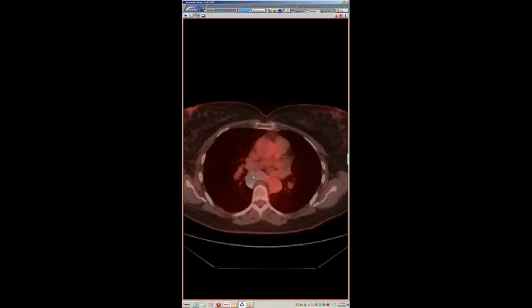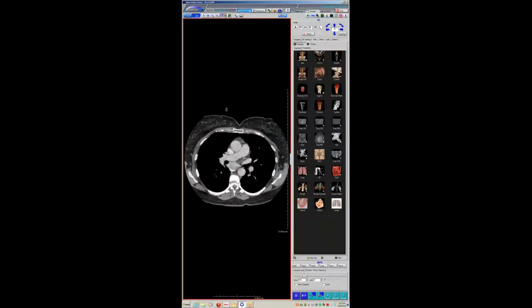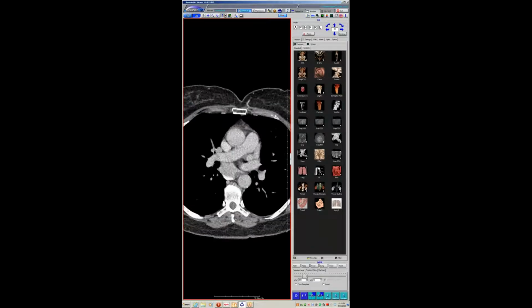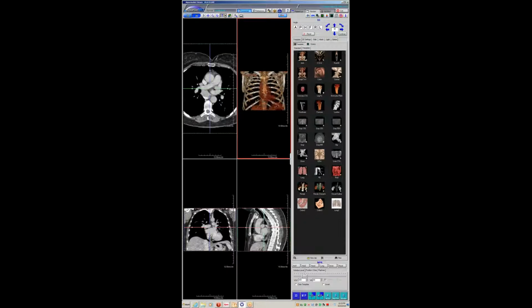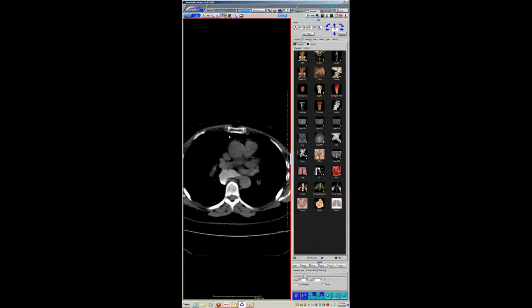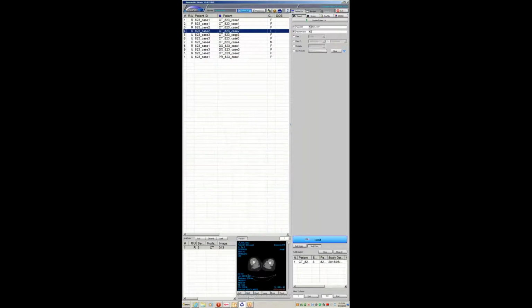But I think on the contrast scan, because the contrast attenuation in the vasculature was similar to the adjacent cyst, there was some confusion about the diagnosis. But it's a classic location and a classic appearance. If you made this fluid attenuation or low density, I think most of us would make that diagnosis. Have other people seen ones this high density? No, I don't think I've seen one, that's the highest calcium. That's really neat. It was right on the PET. You can definitely understand why the confusion was there. But on the non-contrast, it comes out really pretty. So, just an interesting one. I don't think I've seen one that high density before.